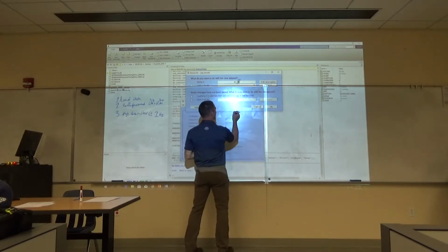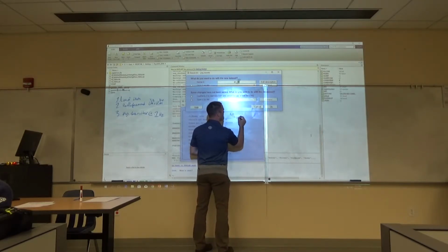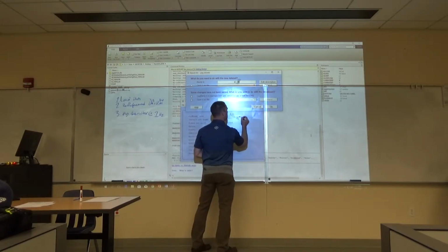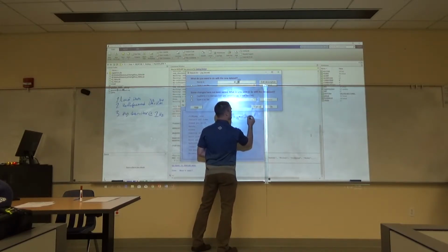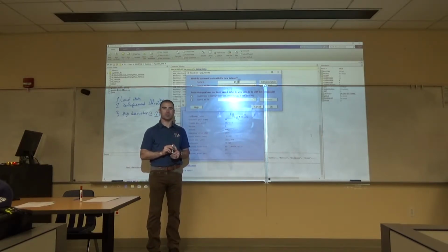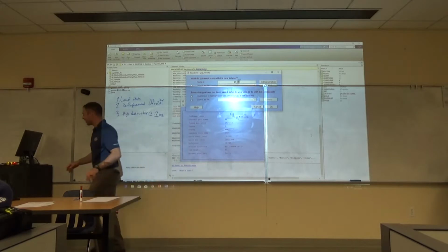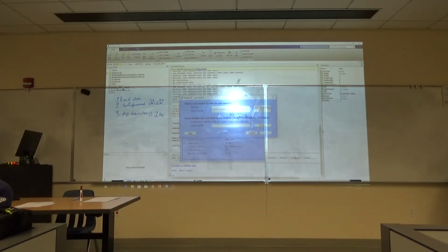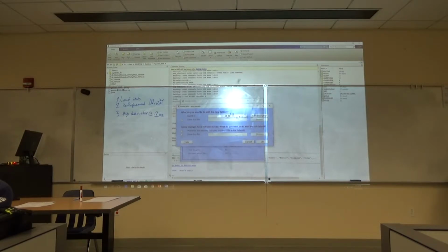Okay. We're going to name it basically 41_. And we're going to do, you might even write out, so if you put the dot for 0.1, it's going to goof up the file name because it doesn't like dots in file names. I'm just saying 0.1 hertz. Okay? Sound good? So let's just do that. Put that right about there.